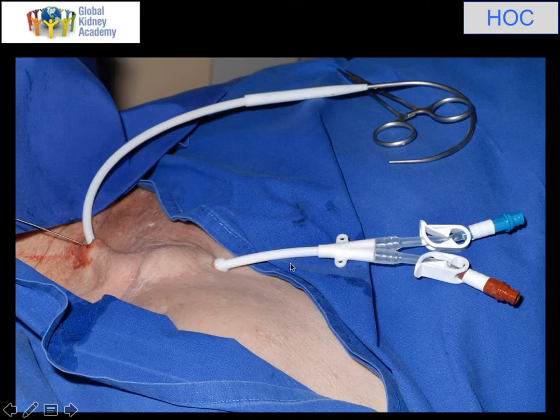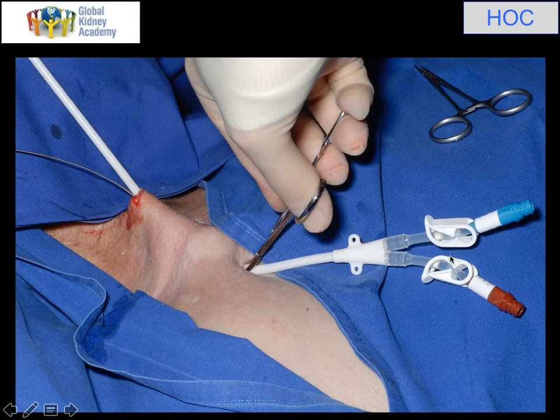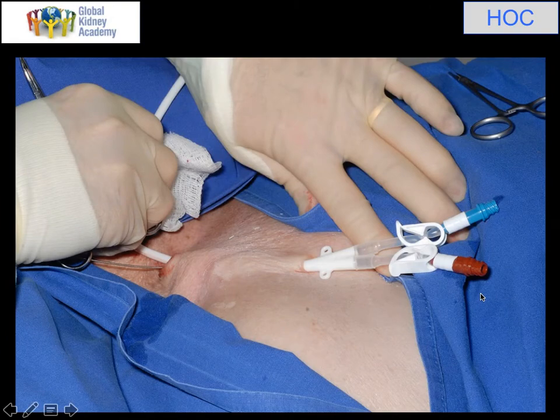We've now got the line partially tunneled. The cuff is too big to fit into the exit site, which is as we want, then running vertical and then coming round. The way we get the cuff underneath is to pop some mosquito forceps under the cuff, slide them round to the top edge with the points upwards, and then as I begin to pull on the line I simply take my mosquitoes out — just open them up and take them out — and then pull. That just moves the skin edge away and allows me to pull the cuff into the tunnel.